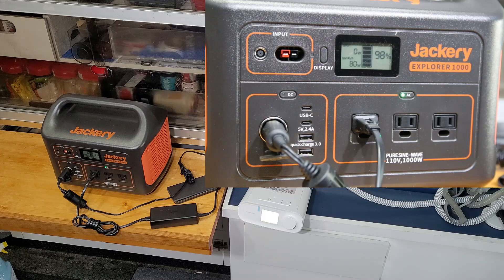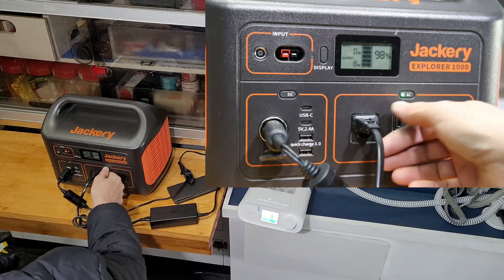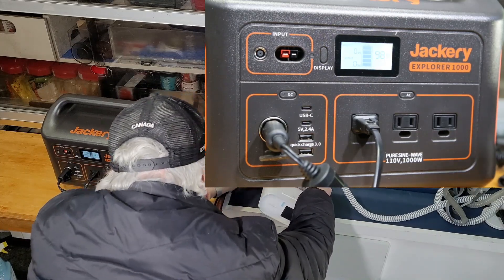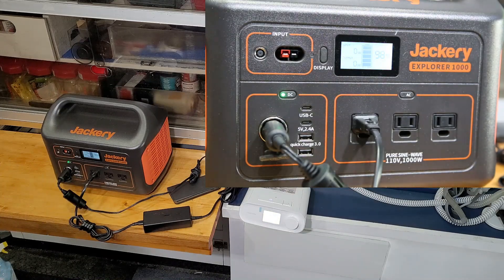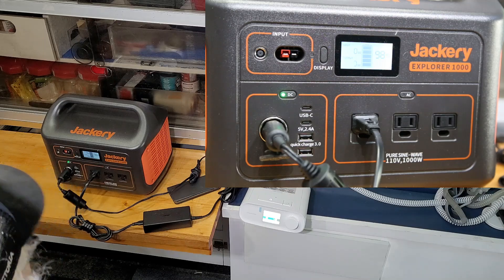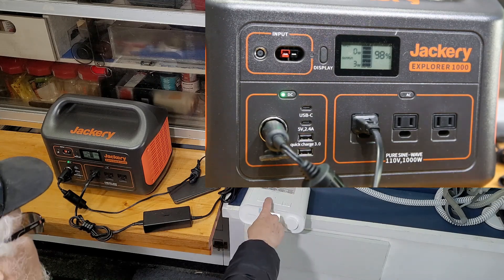I'm going to turn the AC off, then I'm going to plug in my straight DC-to-DC cord — it was an extra purchase from the unit. Now I'll turn my DC on and wait a few seconds for the CPAP to come up. It shouldn't have to read the card now because it hasn't been off that long.